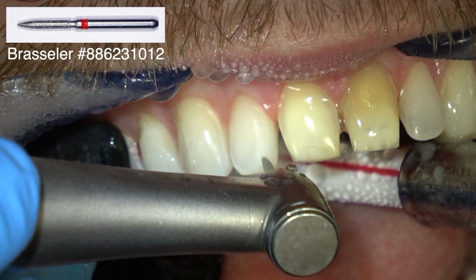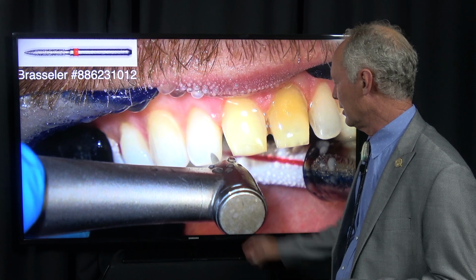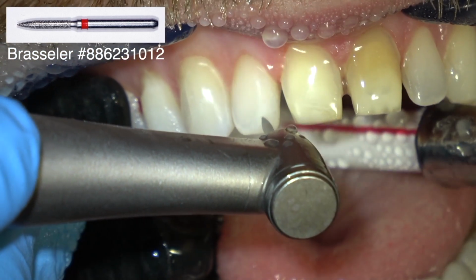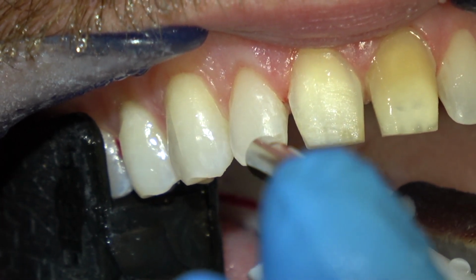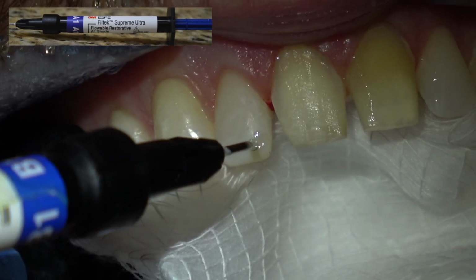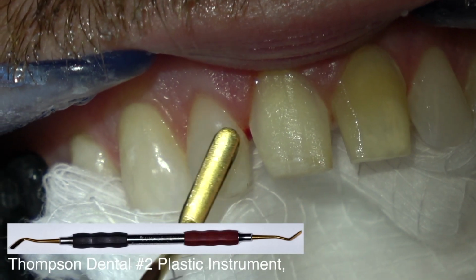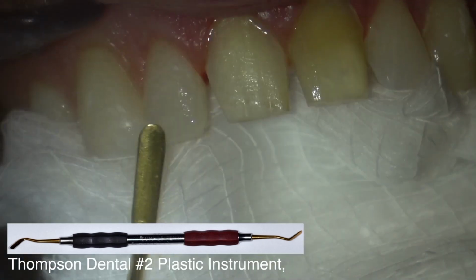See, I had a little tiny void or rough spot, so I'm just using the tip of some burr to open that up just a little bit. In this case, I happen to have a flame-shaped burr on the handpiece, and that's fine. Just open it just a little bit. You don't have to reapply the primer adhesive. See, I open these two areas, get it good and dry, aspirate, isolate, keep the tip of the syringe in the void, fill up that defect, smooth it. This is a very good plastic instrument because the material doesn't stick to this, whatever this is made of.